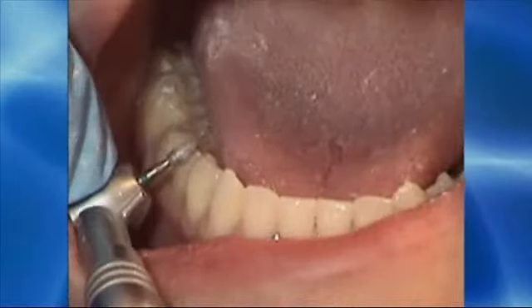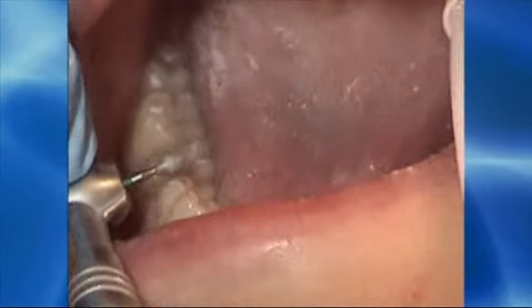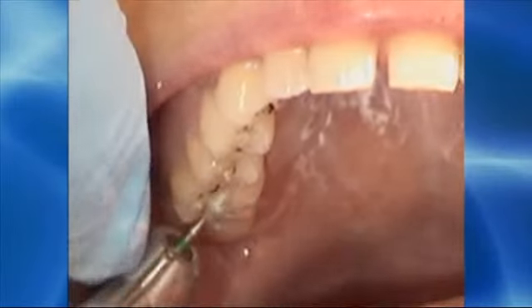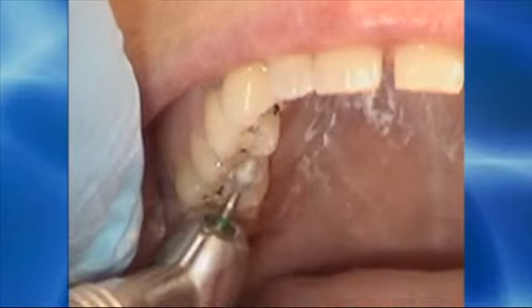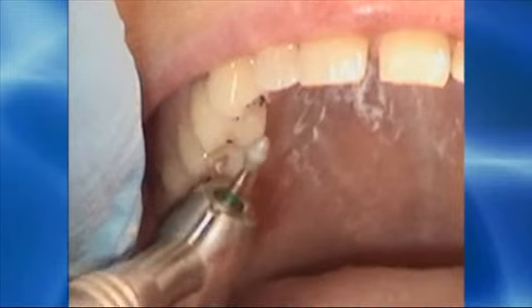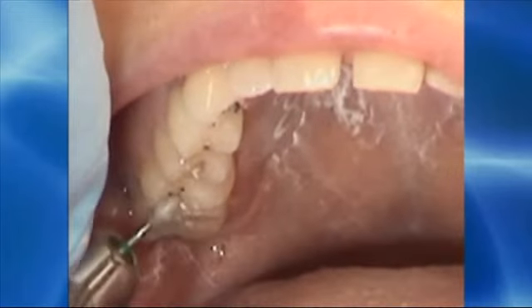Now I'm treating the second premolar, trimming around the cusp tip and working the contact closer to the cusp tip only. On the opposing upper right side, here you see contact in the central fossa on most of the teeth, and slight contact, scratchy little lines, and inconsistent contacts all around the contacts that are desirable in the central fossa on the marginal ridge. A good example is here on the buccal aspect of the first molar.